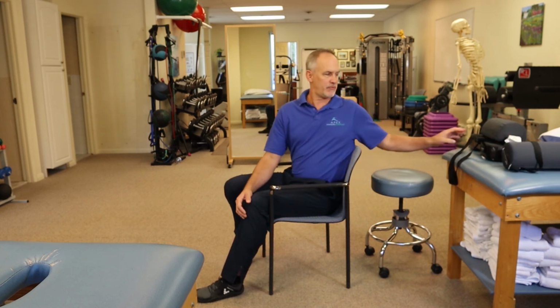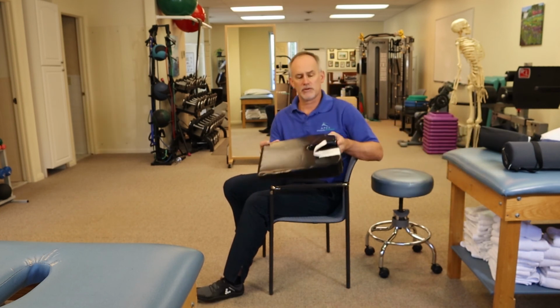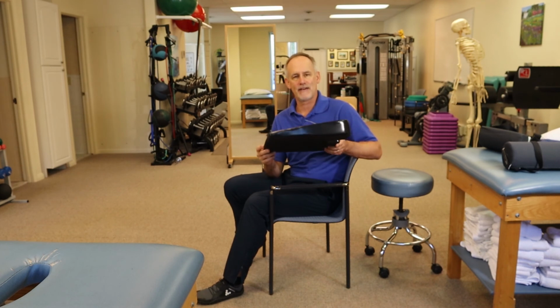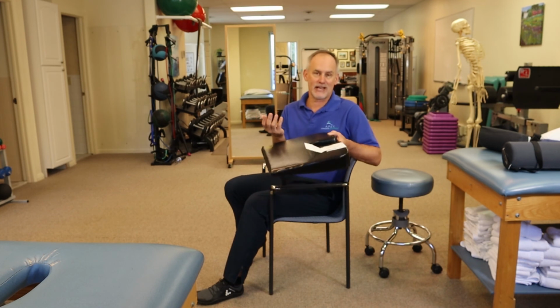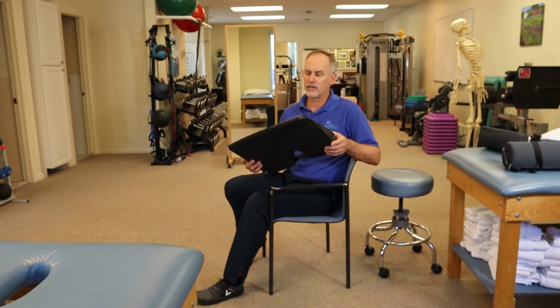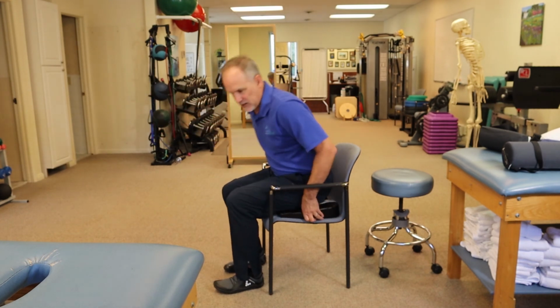One of my last tips before we leave is not typically one we talk about as far as a roll, but this is a little inclined, kind of angled roll. And this is good when you don't have back support, okay? So this one right here you can place, some people use it when you're going to a football game, you're in the stands or something like that where you don't have back support, or a chair that simply doesn't have it. This one right here you can place in any kind of chair.